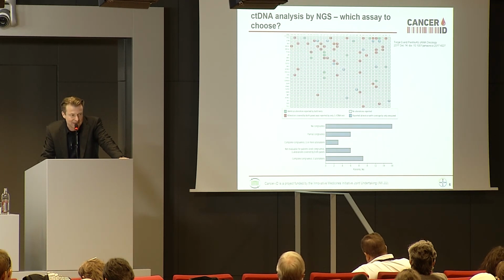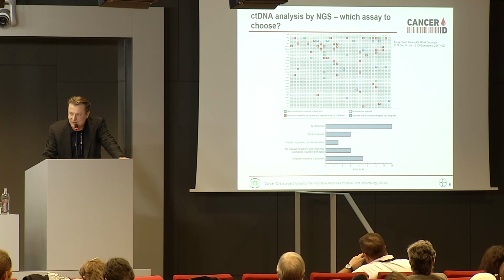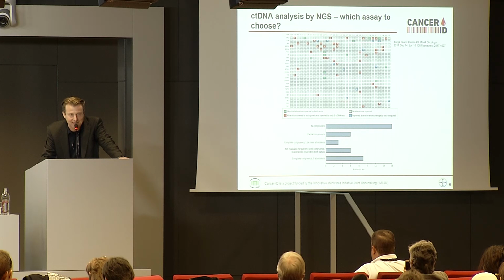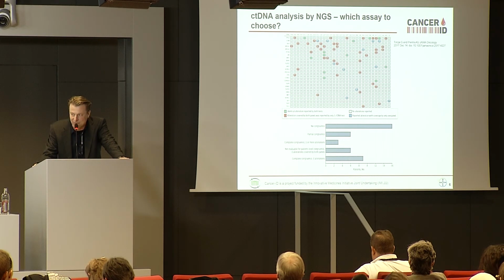Obviously, a single mutation in a single gene may not be enough. So what you want to do, for example, is NGS. And of course, people are doing that. But just to let you know why we feel we need to do a lot more in terms of standardization and to understand much more what a single assay is capable of showing us, this is an example from a recent publication in JAMA Oncology, where a clinical lab sent out a blood sample from a patient or different patients to two providers of NGS in liquid biopsy, and that was the result.